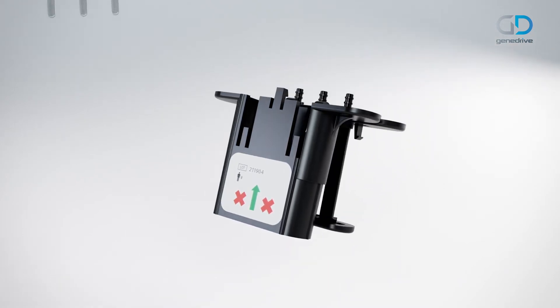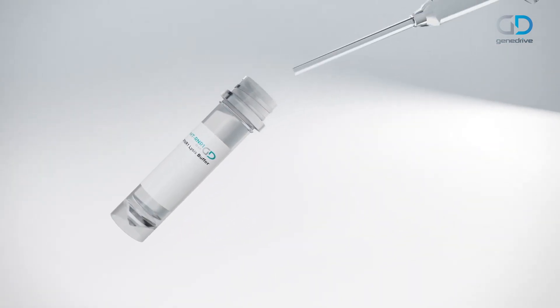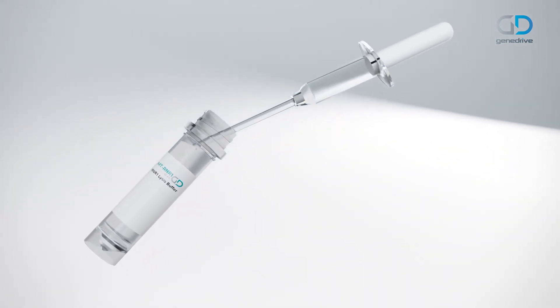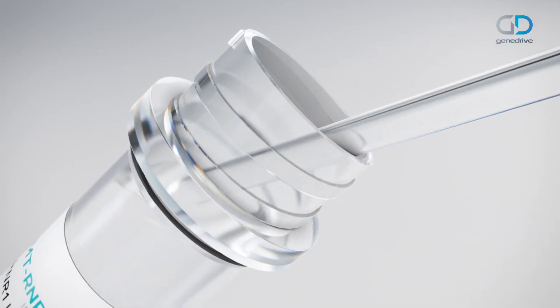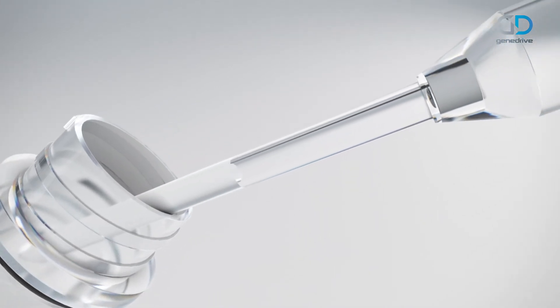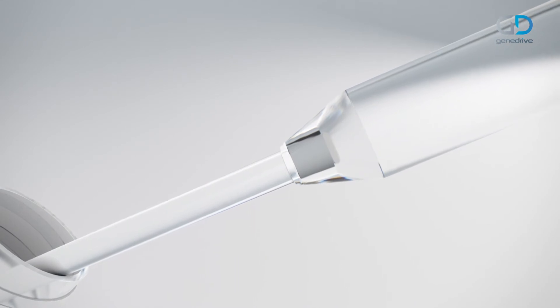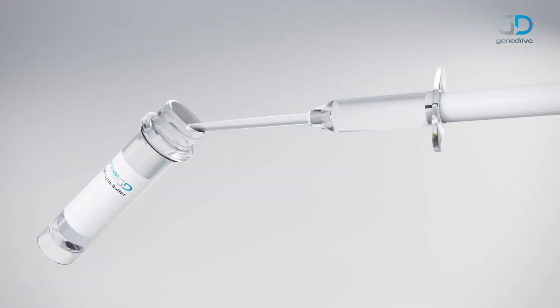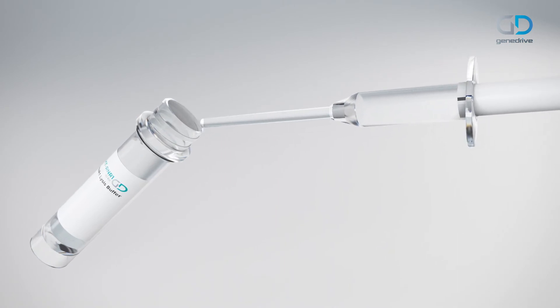Insert the assay cartridge into the holder assembly of the cartridge lid. Hold the Minivet in a horizontal, slightly declined position under the wings. The air ventilation hole at the end of the piston should not be covered, and ensure the piston is not pushed down. Collect the sample by placing the tip of the Minivet under the surface of the sample. Collection is complete when the buffer has reached the filter at the other end of the capillary tip. Ensure any excess liquid is removed by wiping the tip of the Minivet on the edge of the sample collection tube when removing.